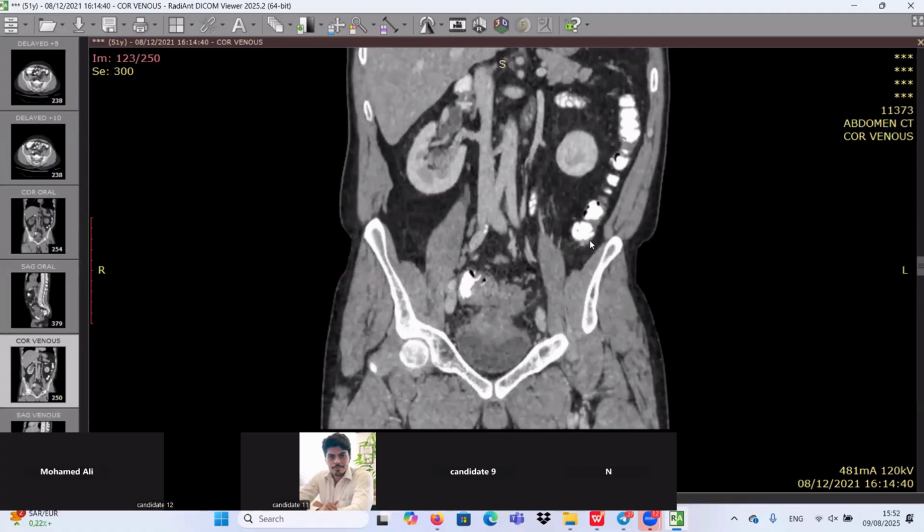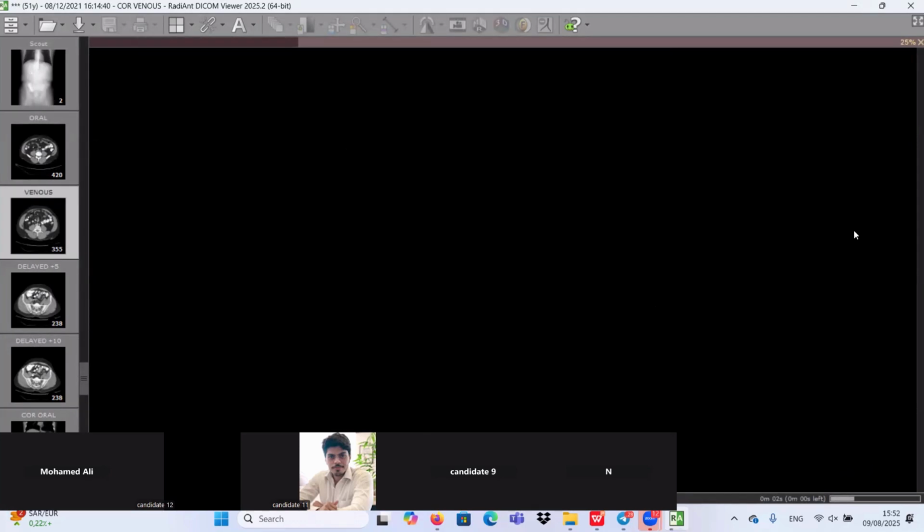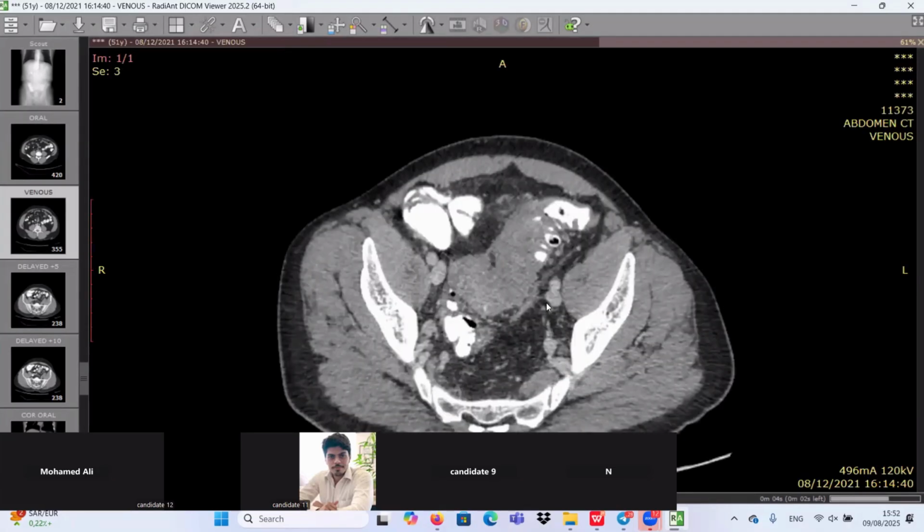I totally agree with you that we have long segment affection of mural wall thickening in the sigmoid colon, and let's review together again, please. I'm sorry to disturb you, but let's review the axial plane again.